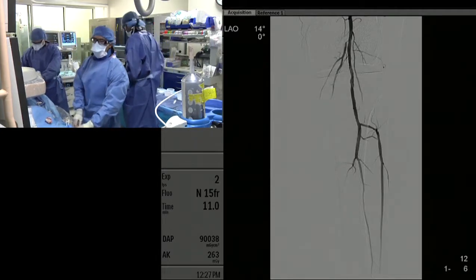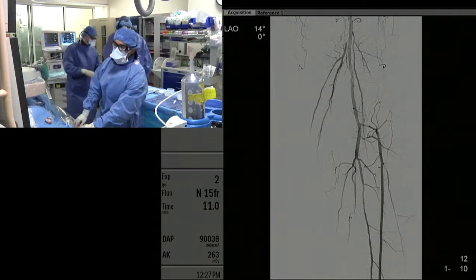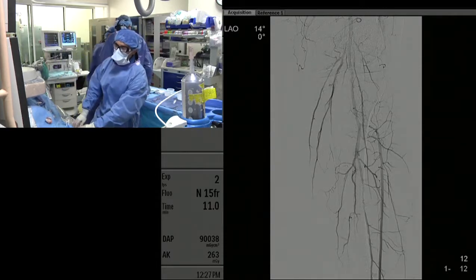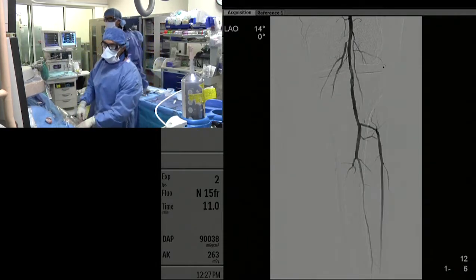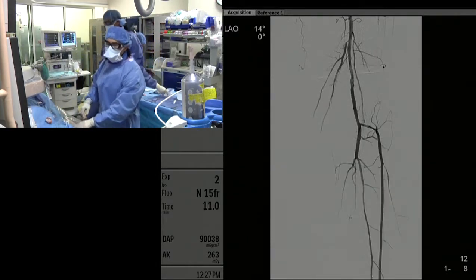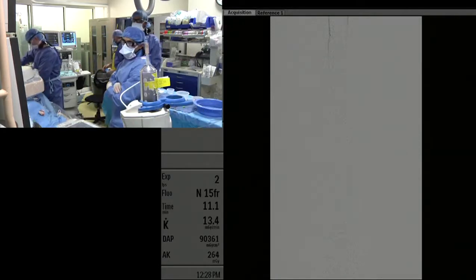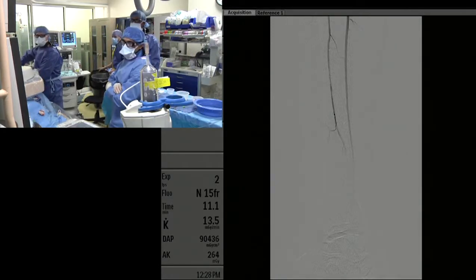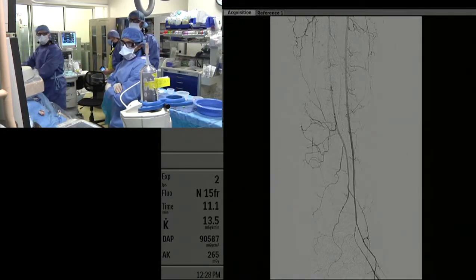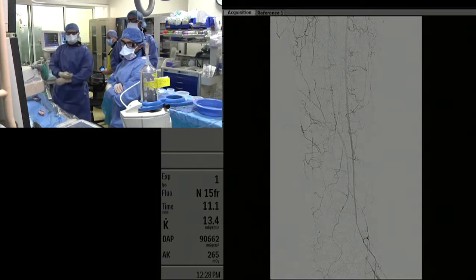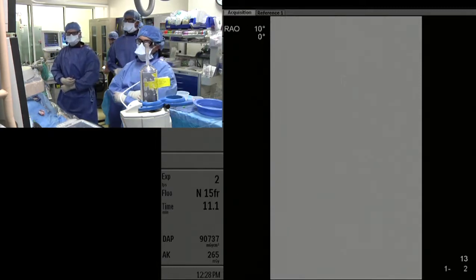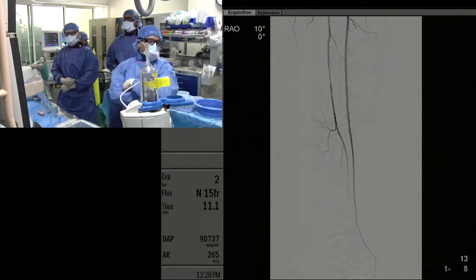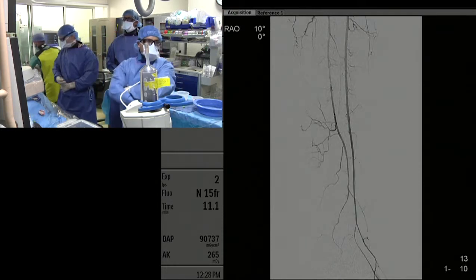You can sometimes get arterial spasm with CSI. If that happens, we'll generally inject nitroglycerin directly into the artery. We're getting much better filling into the calf. I think we're done — would anybody do anything different?